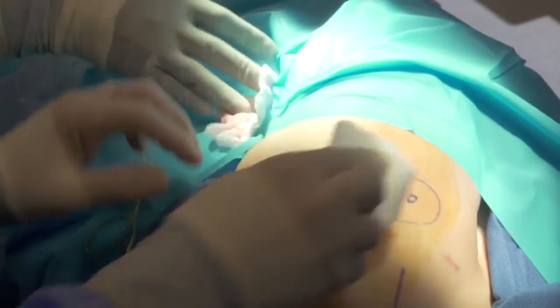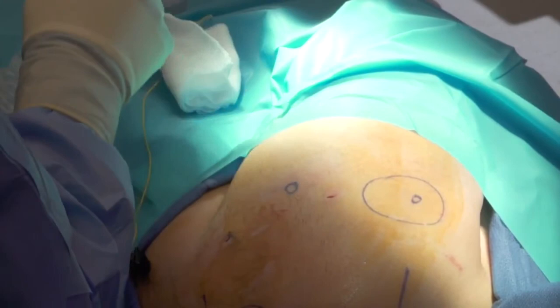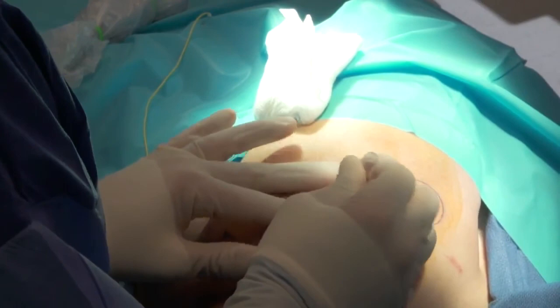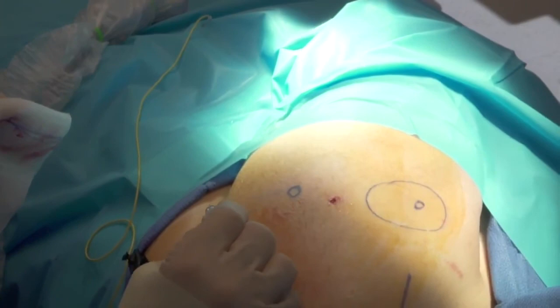Good job. And if I can have that Dermabond, my man. It's coming. Dermabond coming up. He's not going to get a dressing. No dressing. What's that, crazy glue? Cool. Yep, you got it. That's exactly what it is. Good job, buddy. That's it.